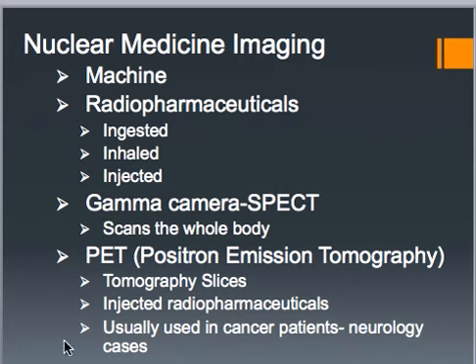It also uses a gamma camera. So in nuclear medicine, we can use a gamma camera or a PET scanner. They're two different things, and most of the time, the PET scanners are used in much larger areas. So the gamma camera, like I said before, is also called a scintillation camera because of the crystal inside. It detects radioactive energy that is emitted from the patient's body, and it converts it into that image. Again, the camera does not emit radiation.